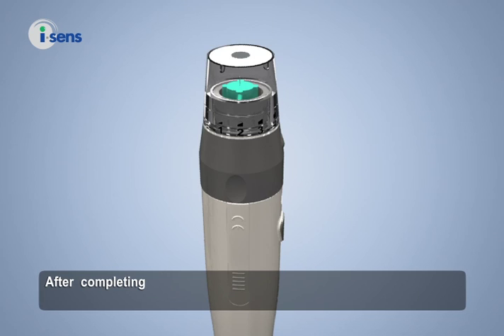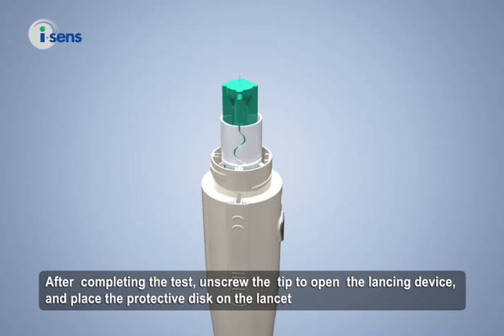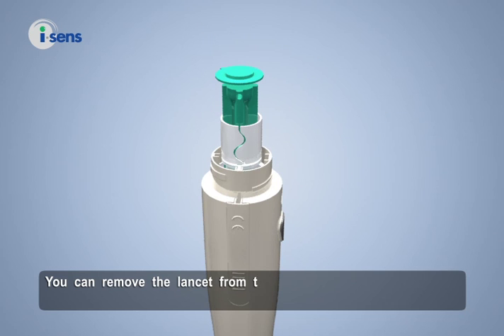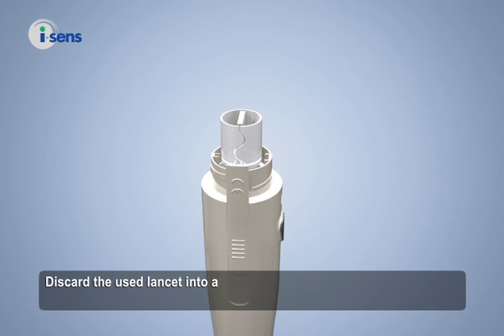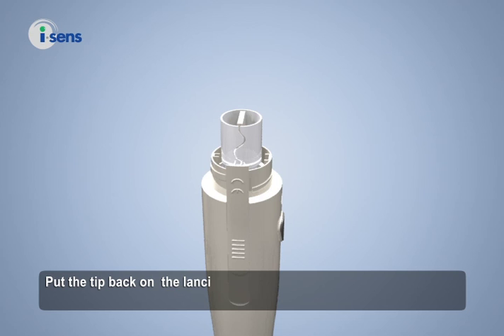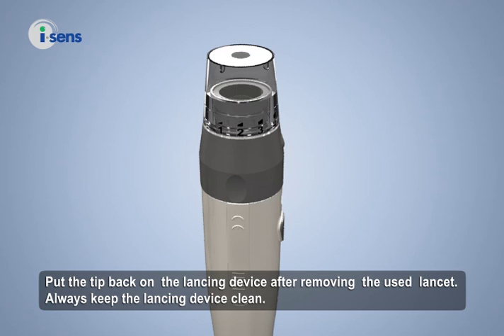After completing the test, unscrew the tip to open the lancing device and place the protective disc back on the lancet. You can remove the lancet from the lancing device by pulling the sliding barrel and pushing the lancet ejector button forward. Discard the used lancet into an appropriate container. The lancet is for single use only — never share or reuse a lancet. Put the tip back on the lancing device after removing the used lancet, and always keep the lancing device clean.